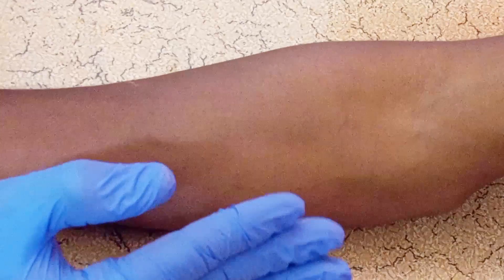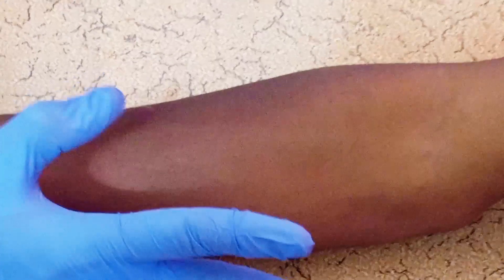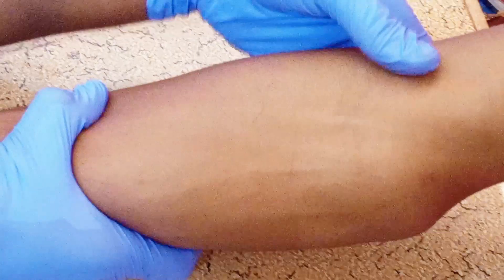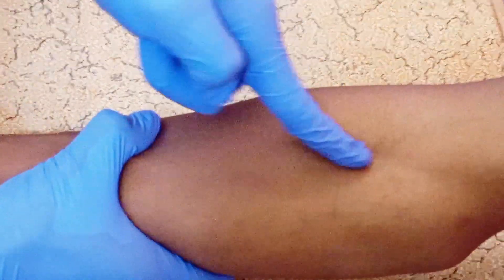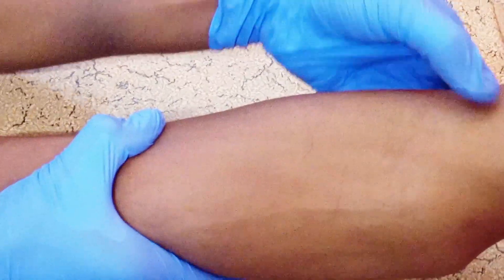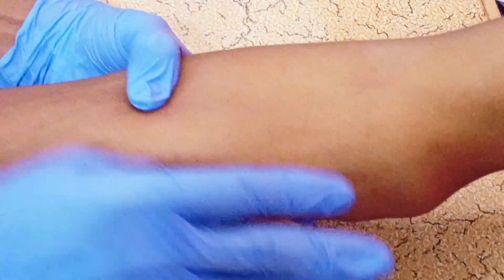For you to take blood, you must have knowledge about the anatomy of veins — that is the order of veins in a blood draw, phlebotomy. For example, we have different types of veins: this long vein here is the median antecubital vein, this is the cephalic accessory vein, and this is the basilic vein.